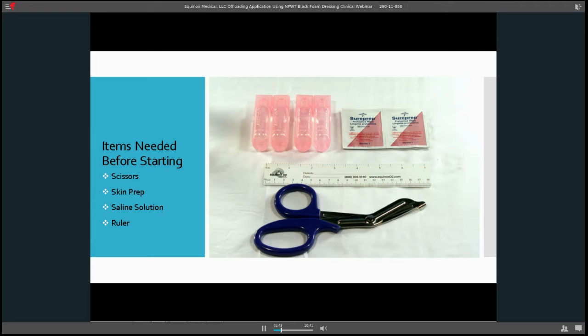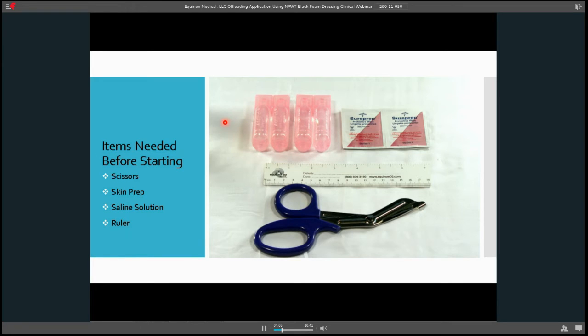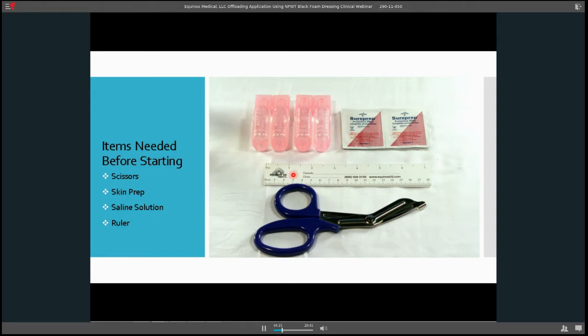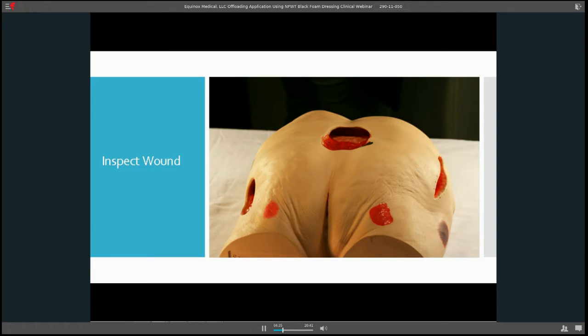If you're a clinician or a salesperson, I'm going to try to speak to both. This is the basics of what you're going to want to bring to the room. You're going to have some type of irrigation solution, normally normal saline. These are bullets, I think it should be much bigger, so you have adequate ability to actually irrigate out the wound, especially if there's tunneling or undermining. Some type of skin prep per the facility's protocol, a measuring device, a pair of scissors. I always think it's great to bring a flashlight, maybe some 4x4s, so that you can actually get in there, see the wound, and dry the peri wound so you'll get an optimal stick for the transparent drape.